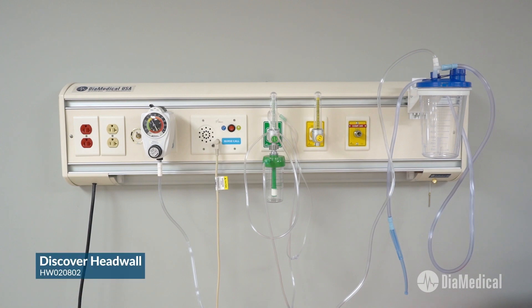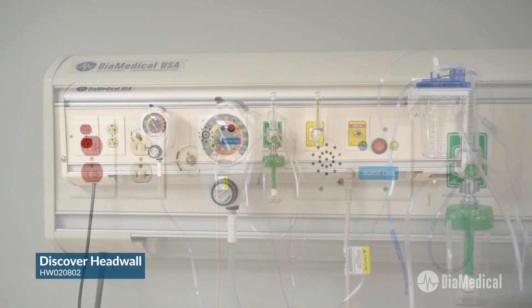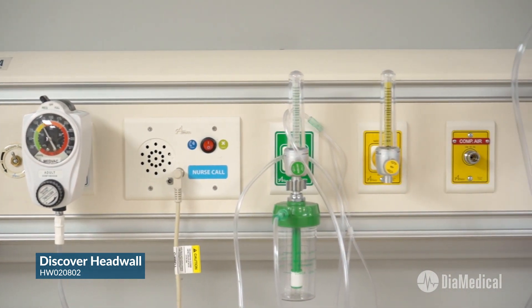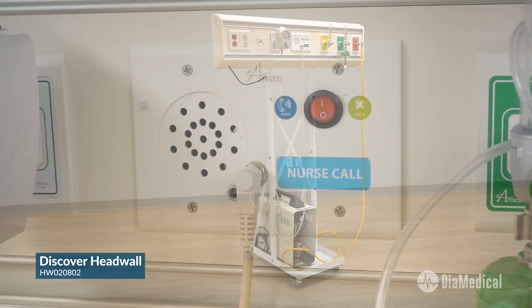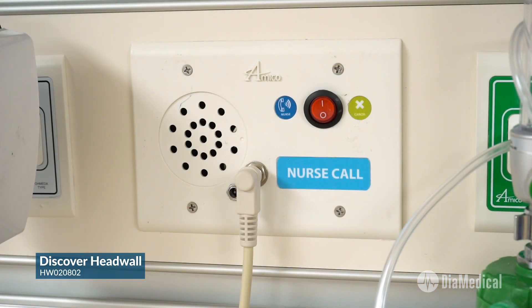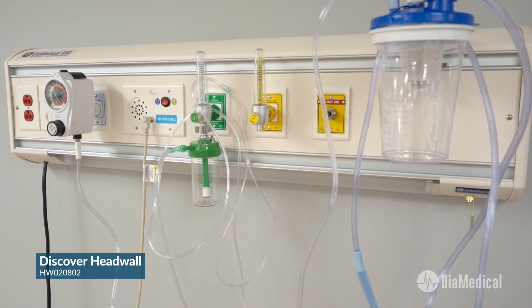The functional 36-inch Discover head wall is more appropriate for RN and LPN programs. It provides suction, air, and simulated oxygen with a silent air compressor. It includes a simulated nurse call button as well as the complete accessories package.